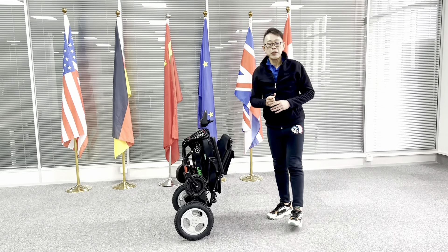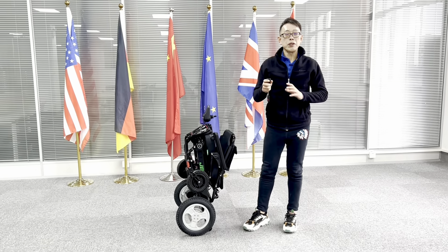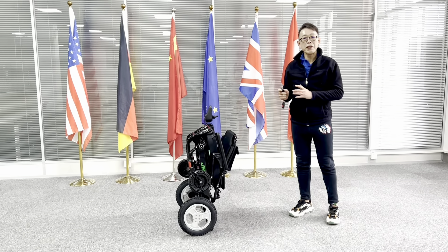Hello, my name is Kevin from JVH. Today I'm going to introduce another new model which is featured with remote control fold and unfold.